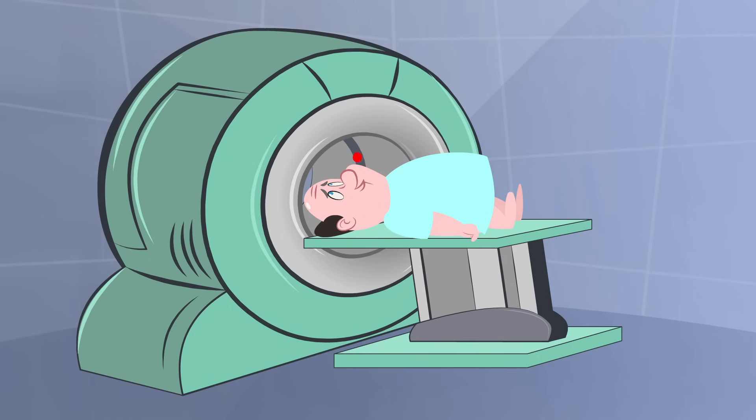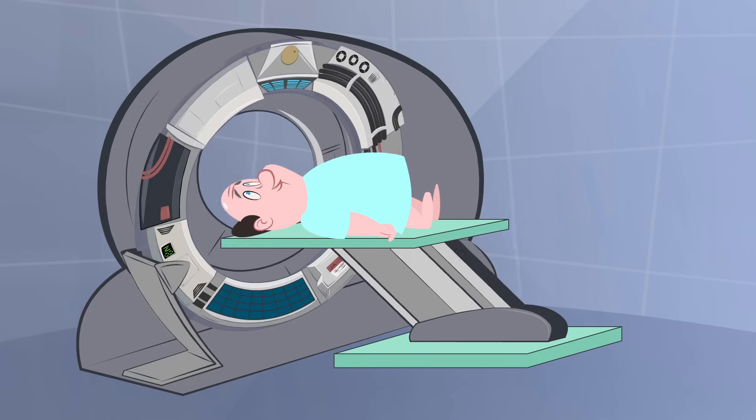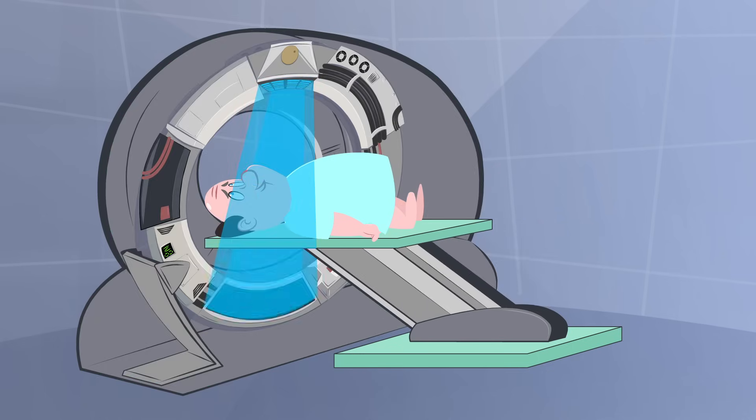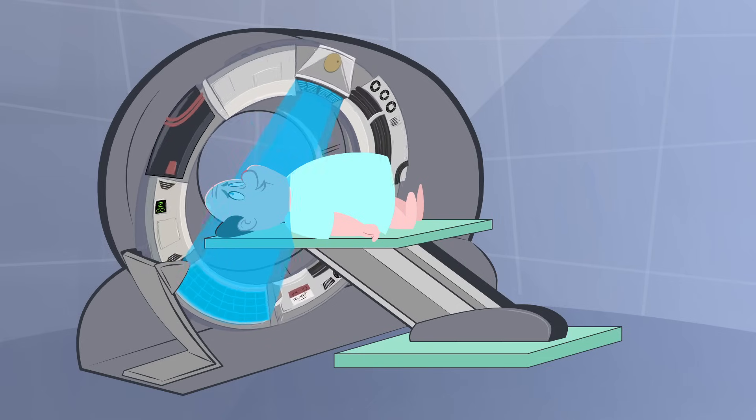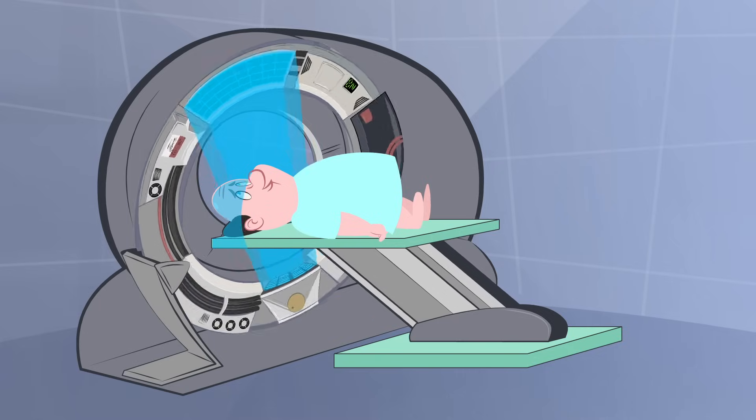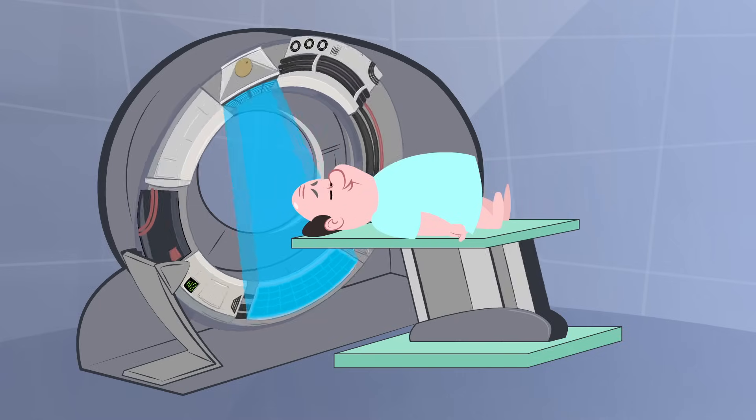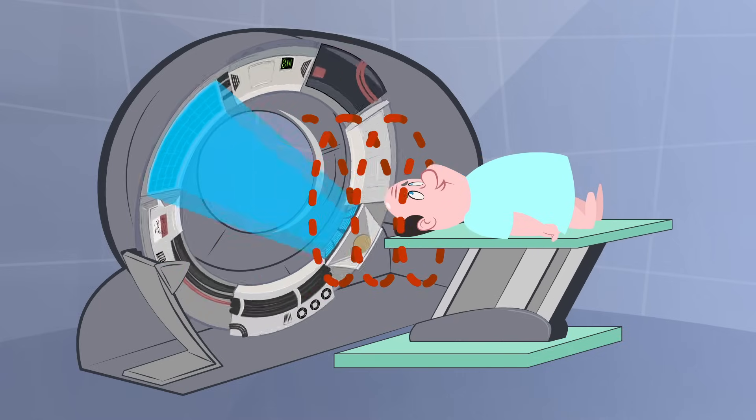A CT scanner works by sending a fan, or cone, of X-rays through a patient to an array of detectors. The X-ray beam is rotated around the patient and often also moved down the patient's body, with the X-ray source tracing a spiral trajectory.